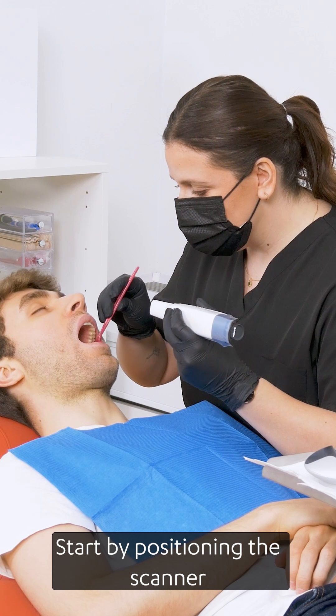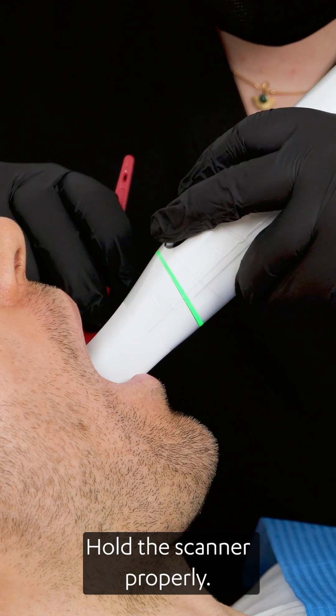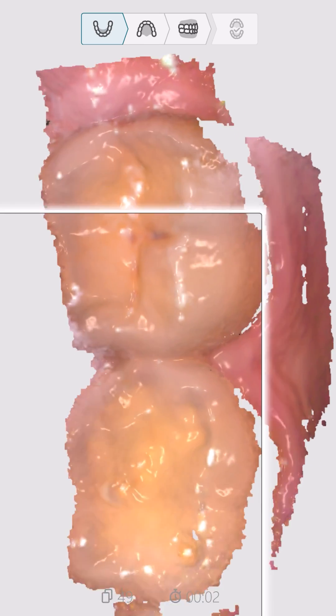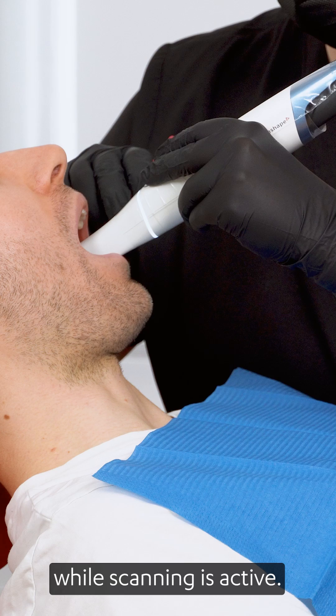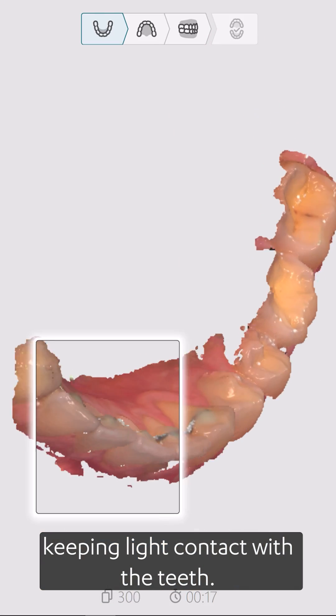Start by positioning the scanner on the occlusal surface of the lower molar. Hold the scanner properly, press the scan button and begin scanning. The LED ring will change to white while scanning is active. Move the scanner smoothly from the molars toward the incisors, keeping light contact with the teeth.